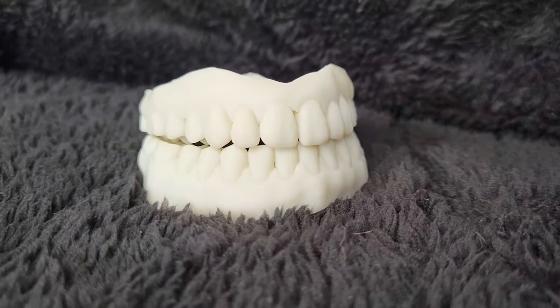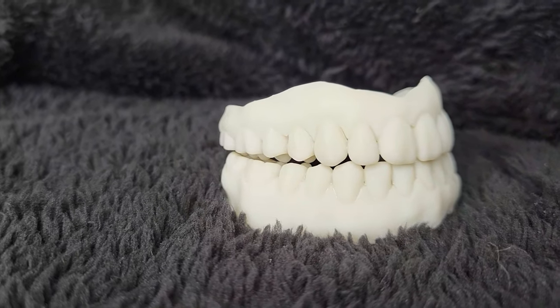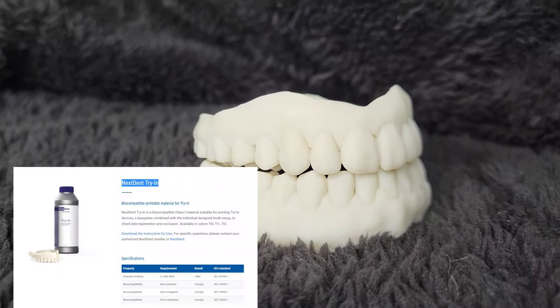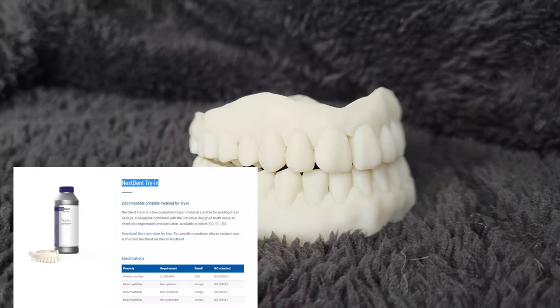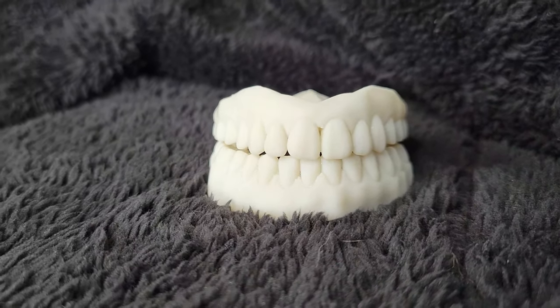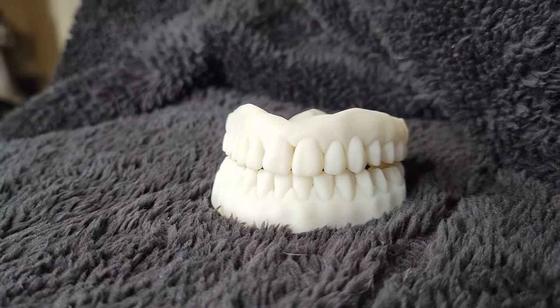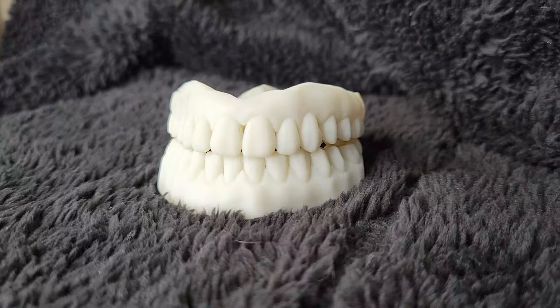You can't put wax in a printer. So yeah, they're all white. These are actually made from a NextDent material. They're the leading brand for 3D printed material. It's a biocompatible class one material used for printing in the designed tooth setup. So these are not wax.